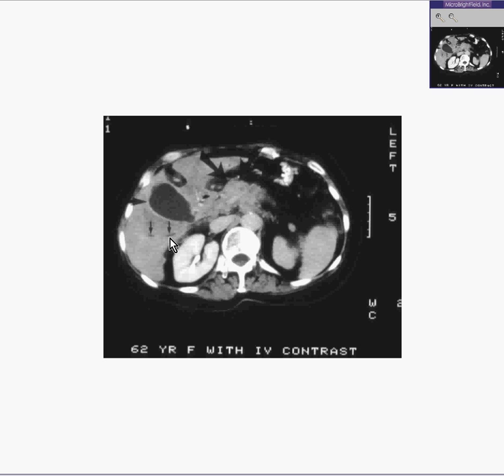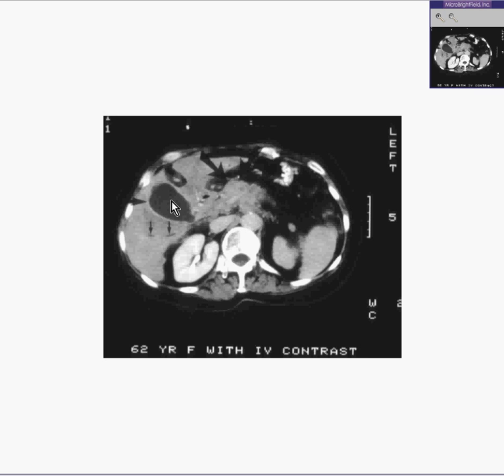These linear things are dilated bile ducts as well. And what pieces the whole story together is that if you look at the pancreas, which is right here, it is non-uniform and irregular in the head region. So if there was a carcinoma obstructing the head of the bile duct of the head of the pancreas, it would result in this and in this.